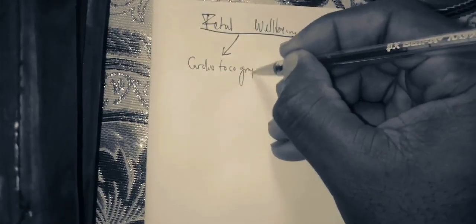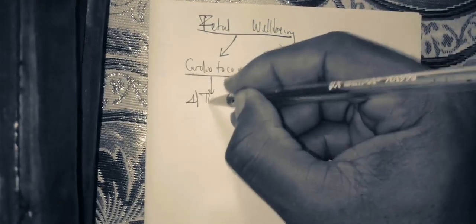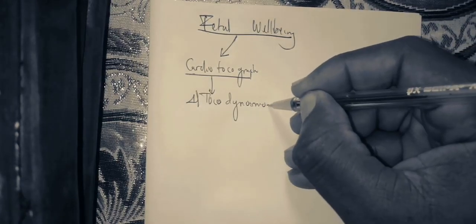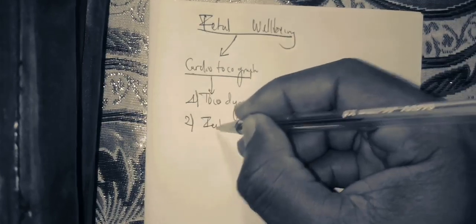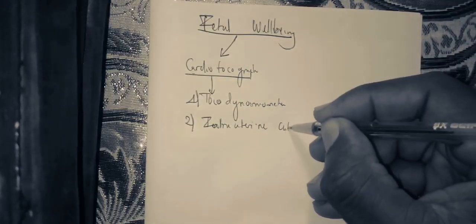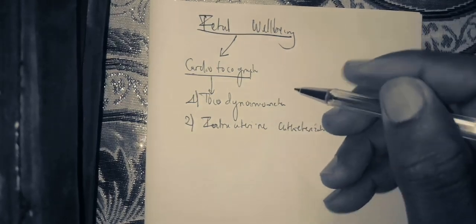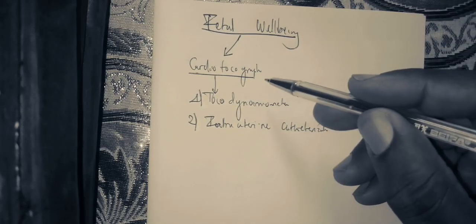cardiotocograph. Is it clear? For the cardiotocograph, we use machines called the tocodynamometer, or we use intrauterine catheterization to visualize it. Is it clear? So we use tocodynamometer or intrauterine catheterization to measure these cardiotocographs.